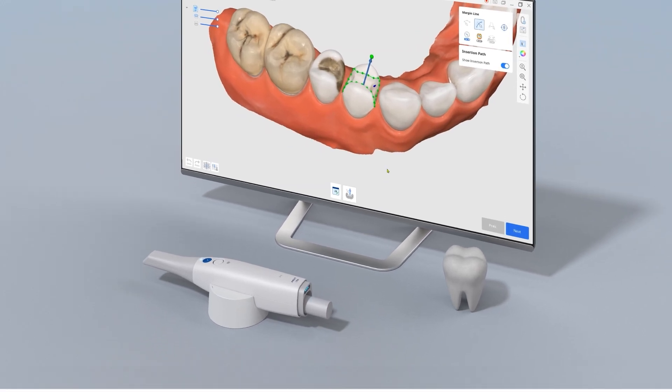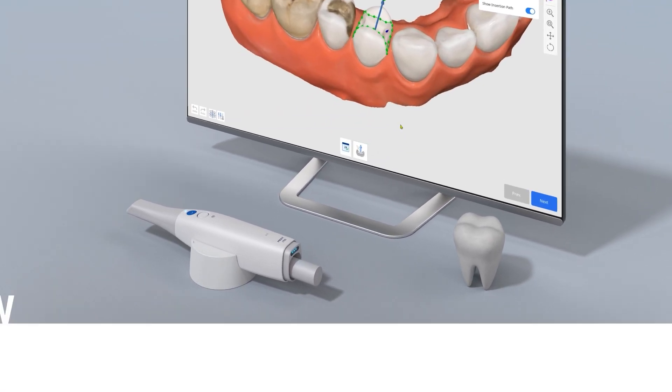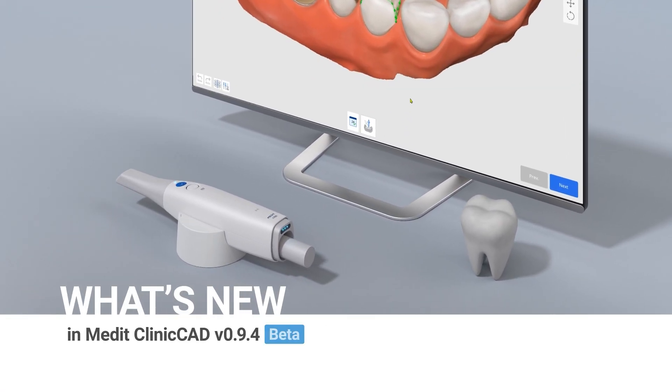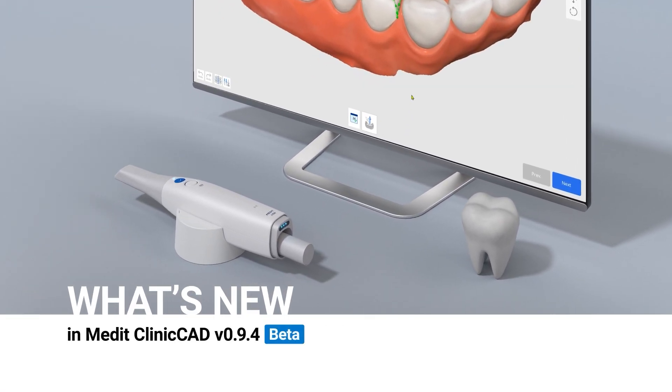We'd like to introduce the updated open beta of Medit Clinic CAD. Let's start with the new features.